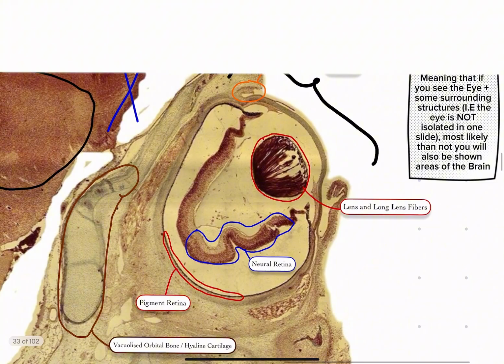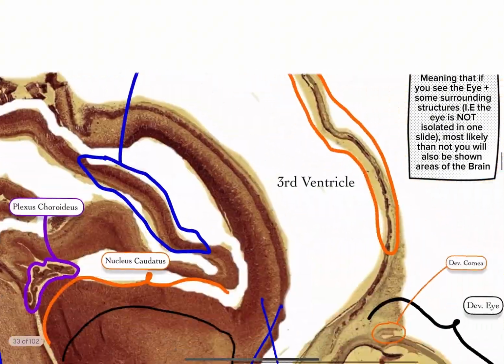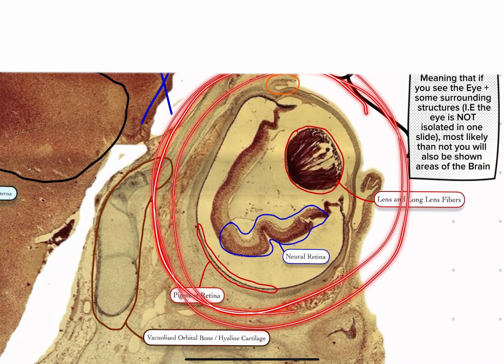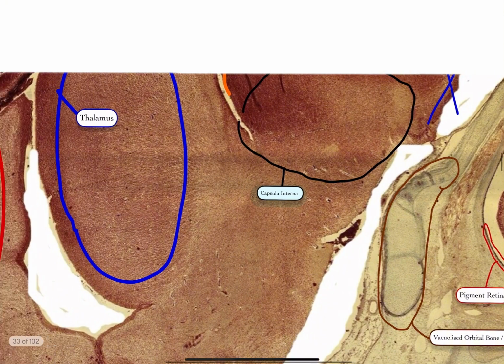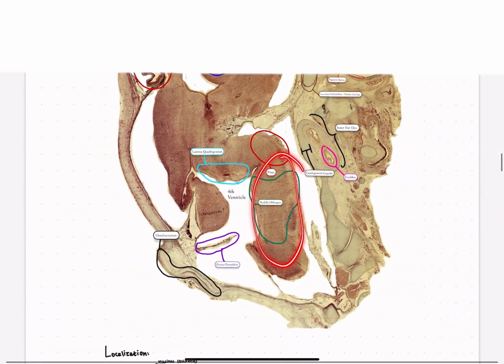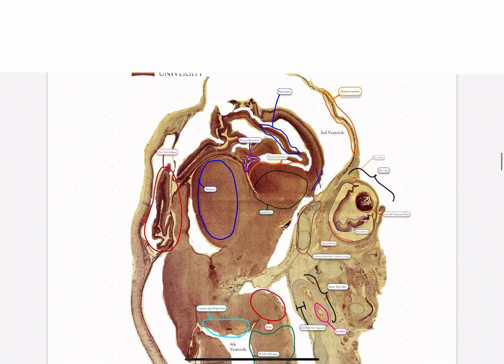Usually professors will show you the slide first, in its entirety, zoomed in, and then they'll show you especially those important markers that will help you recognize where you are, and then they'll get into the actual slides or the structures that matter, for example, the medulla oblongata. Now, in my opinion, the structures that I found the professors talked about the most, i.e. were the most important, were these following structures.